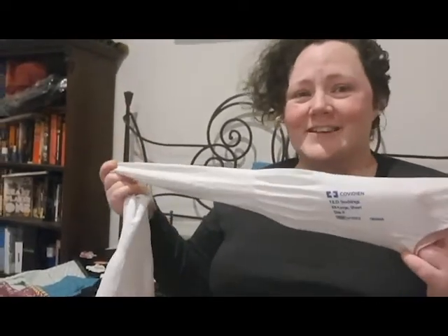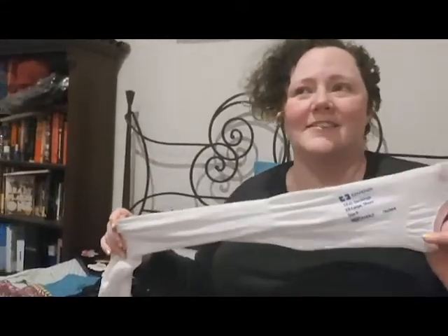I don't wear these all the time. I tend to wear them only when I know that I'm going to be anywhere with my leg down for a while. So like if I've flown anywhere, I've been wearing a compression stocking because I know that no matter what you do, you're going to be forced to sit down for hours on end, and I swell up anyway on planes, so might as well.